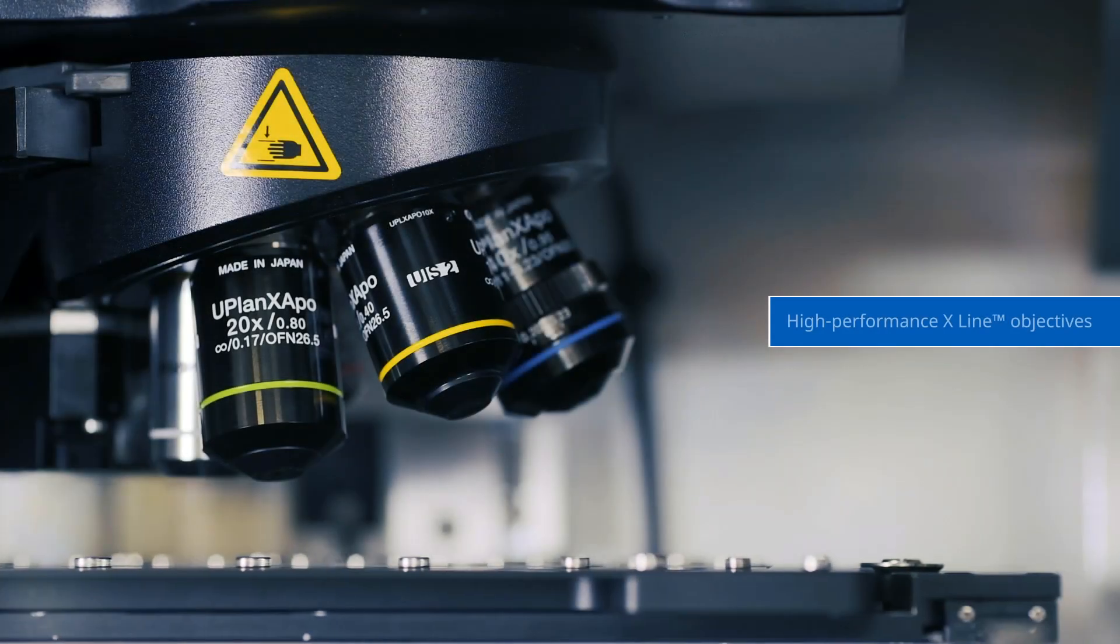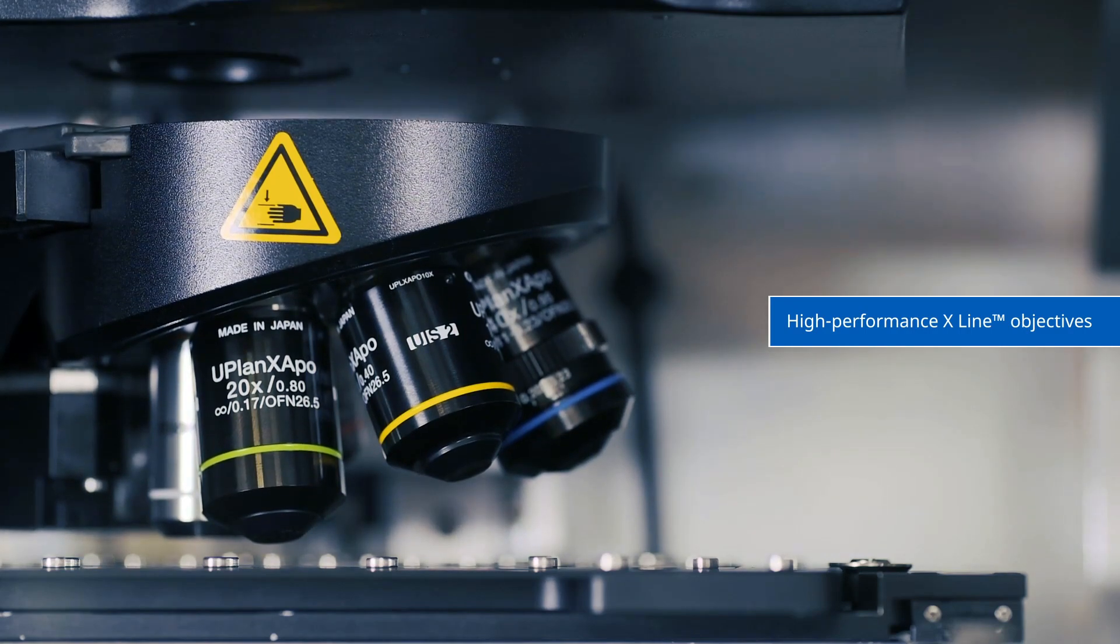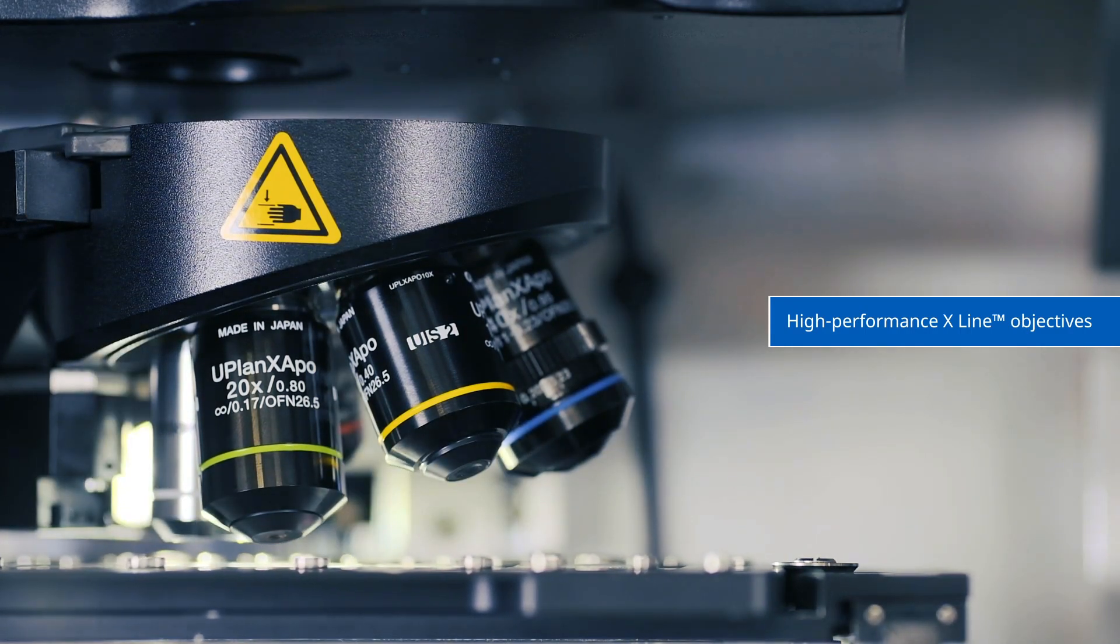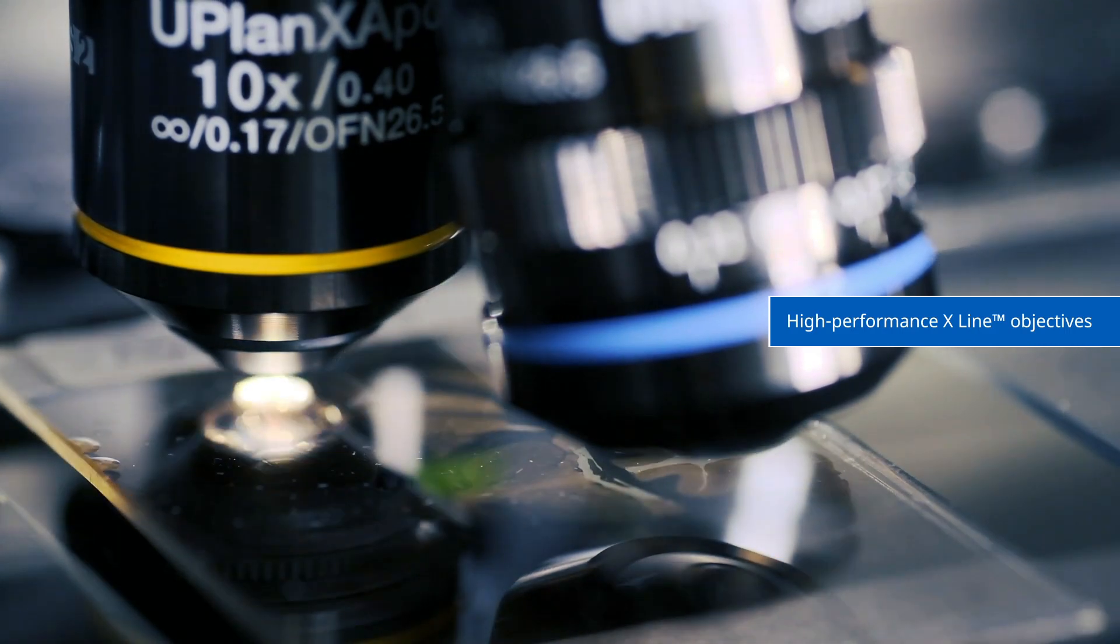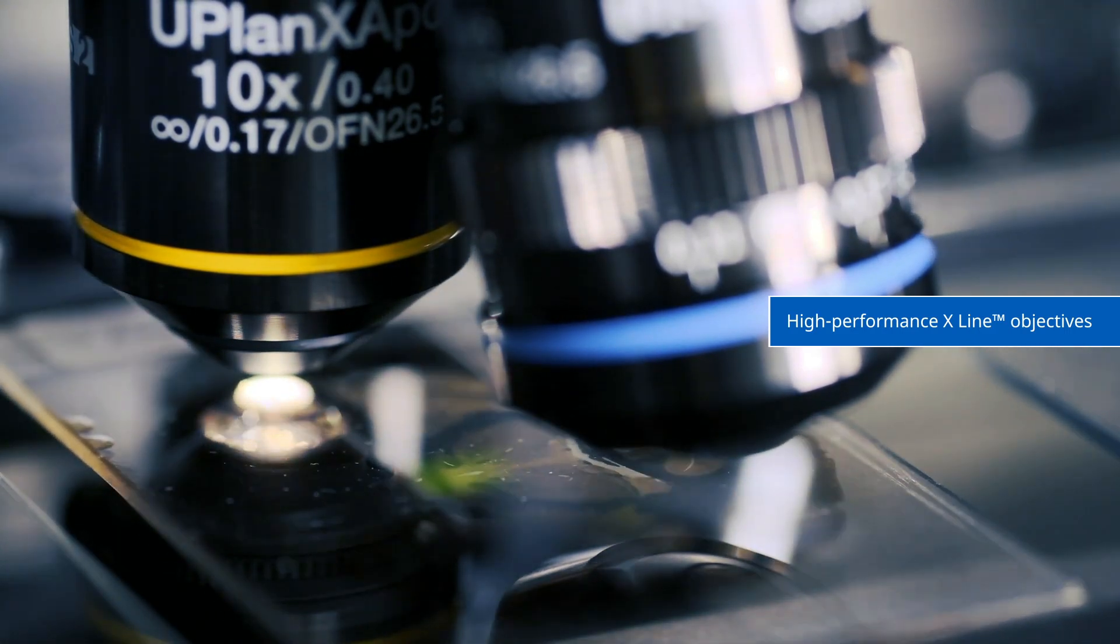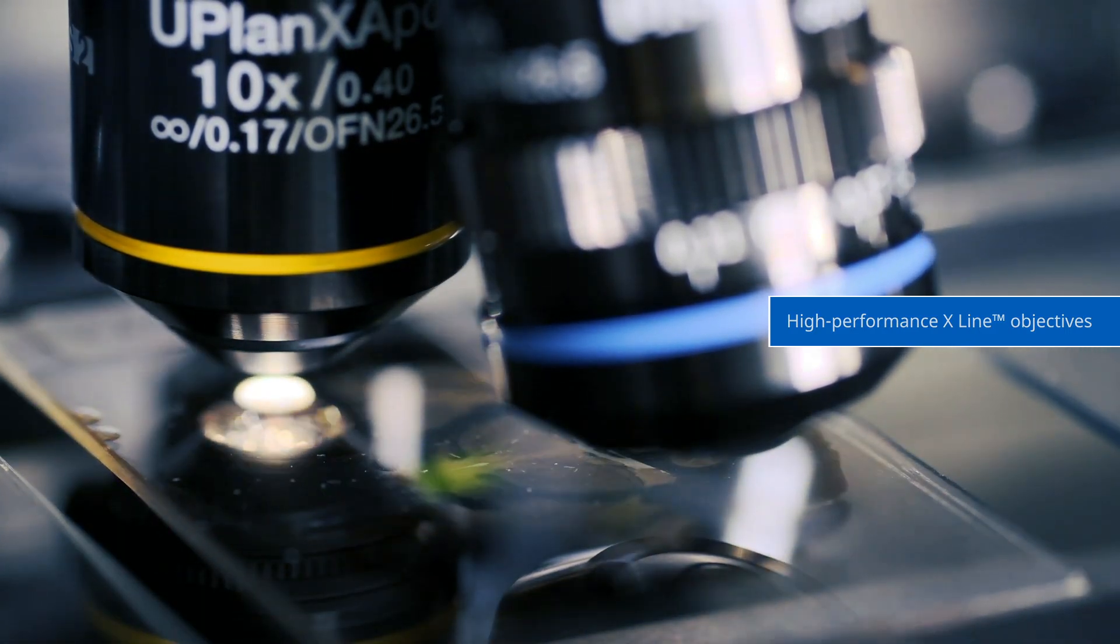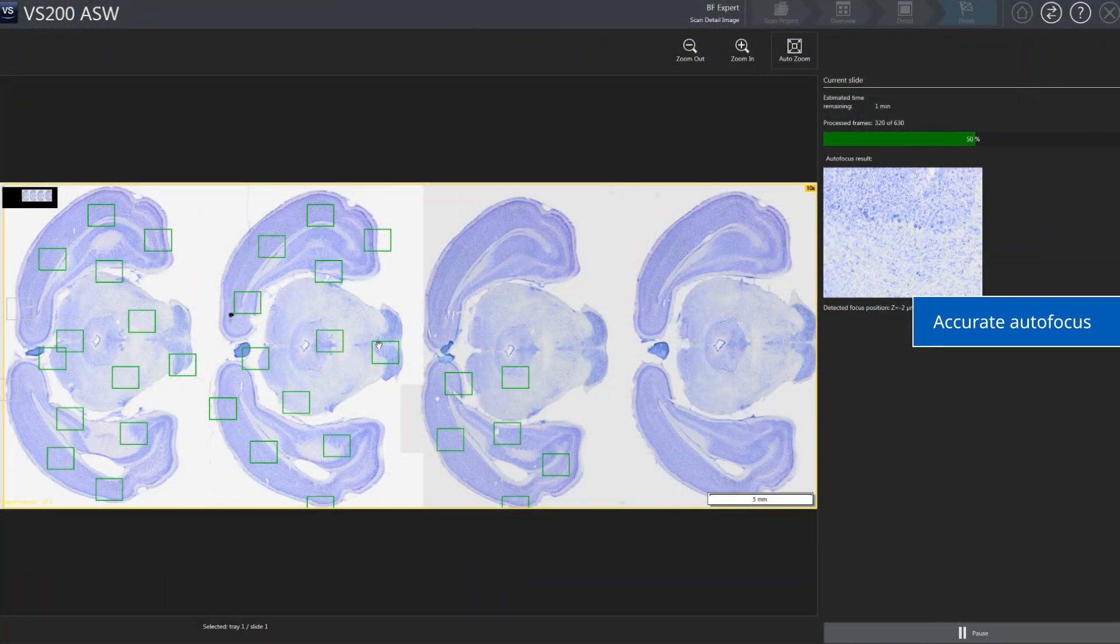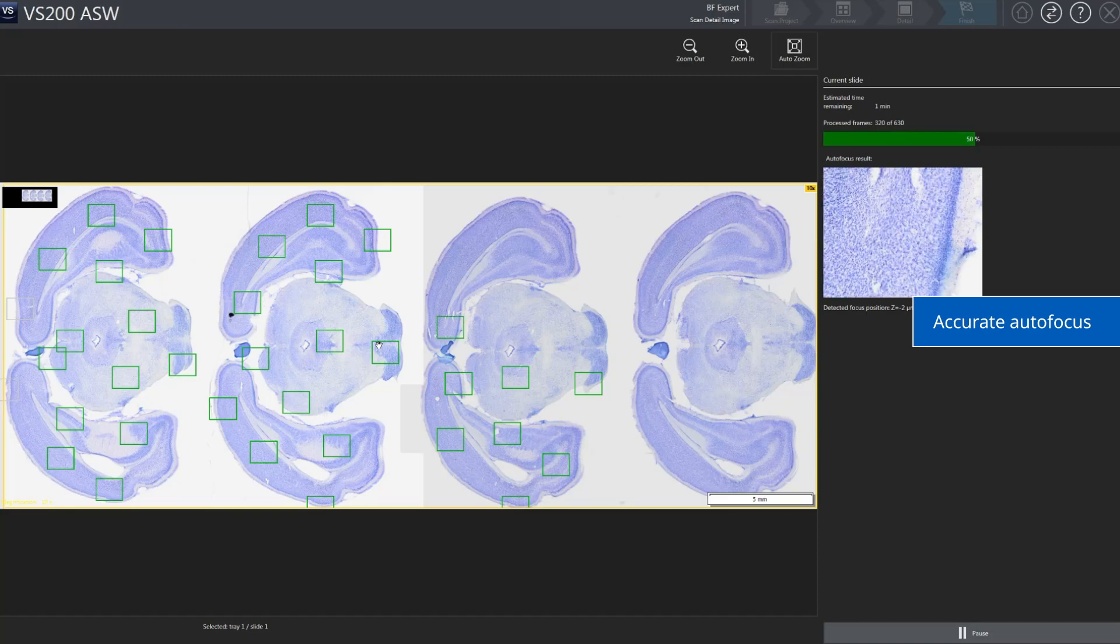The optical system is optimized to work with our high-performance X-Line objectives to improve resolution and flatness for precise imaging. The autofocus works accurately across large and uneven sample regions at all magnifications.